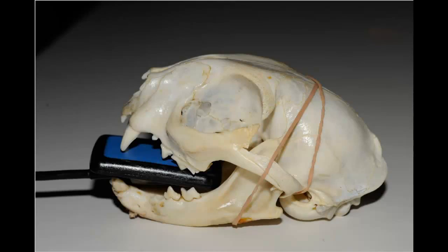Dental radiography on cats can be especially challenging due to the very small area that we have to work with. As you can see here, this sensor, which is identical to a size 2 film, is pretty much filling up the mouth on this very small cat skull.